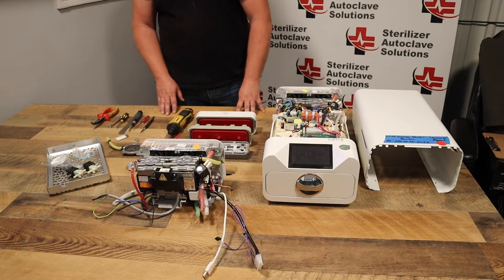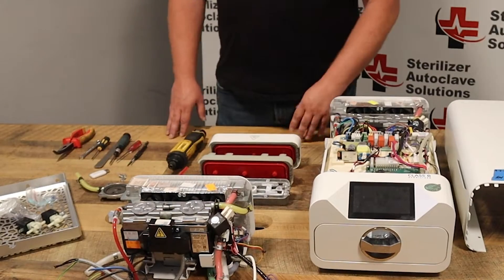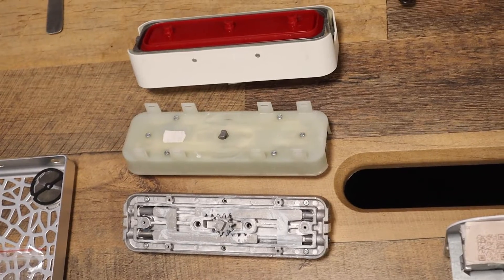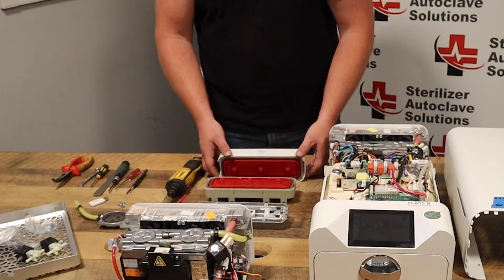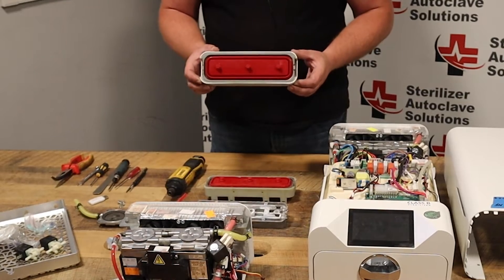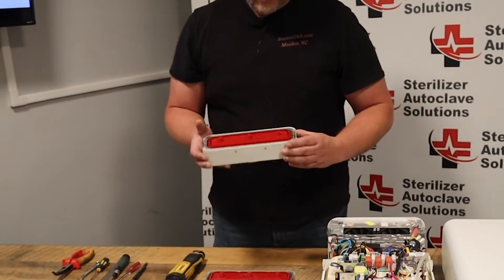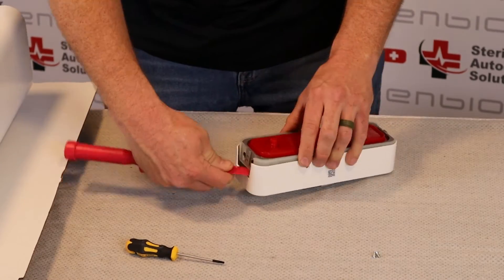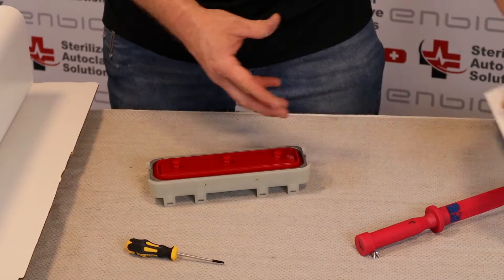It should be done by a service technician — it is not end user friendly. The first thing that would be changed on it is the door gasket. I brought in three examples of why it should be done by a technician. You first have to remove the complete door from the tray rails. Once you do that, you have to remove these two screws and separate this from your door plastic.